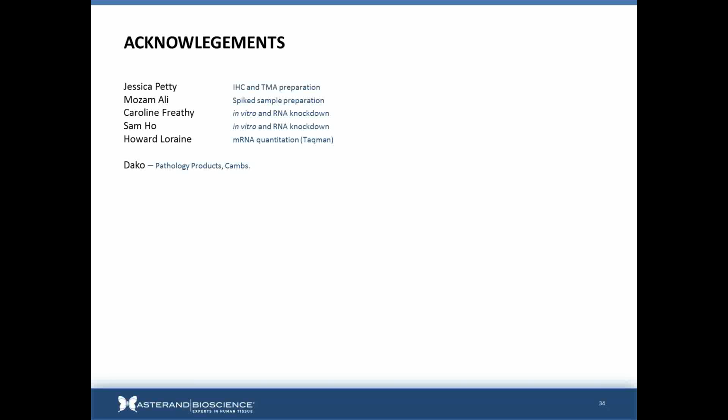Last question here, if we're interested in working with you on this type of project, what do we need to provide? For example, antibodies, that sort of thing. Of course, antibodies, if you can provide control cell lines, both positive and negative, ideally over a range of levels of expression, that's helpful. If you can provide us with full-length recombinant protein, or if it's partial recombinant, we need to know exactly its characteristics. And if you can provide us with other information, that's also extremely helpful. We can, of course, buy these as well, but it's easier if you provide us with well-characterized materials from your own lab. Those are the 3 questions to answer.